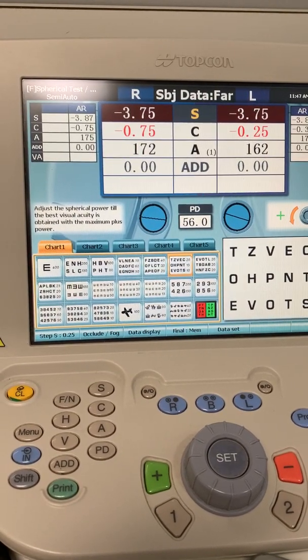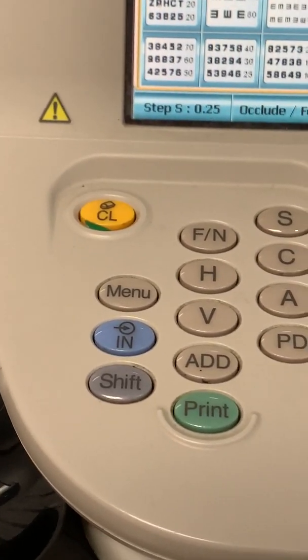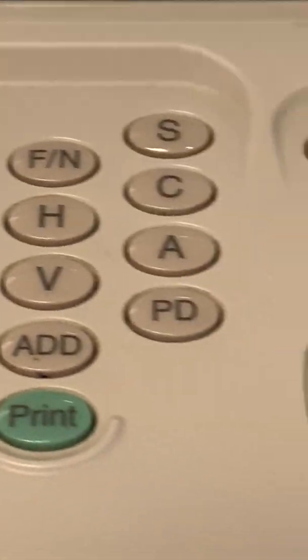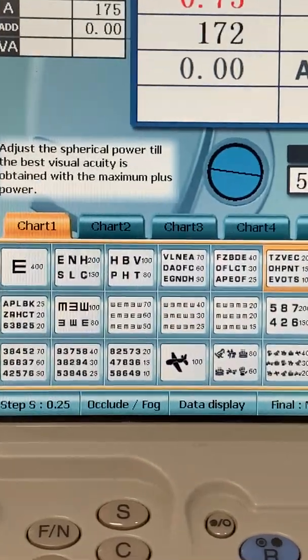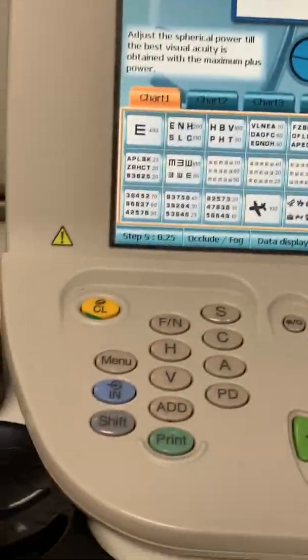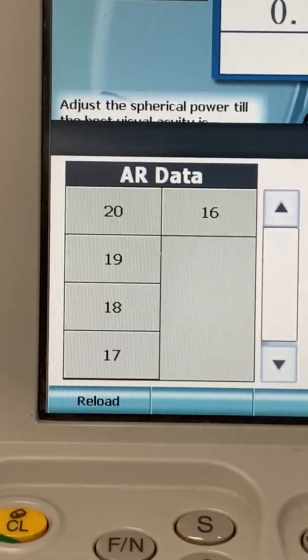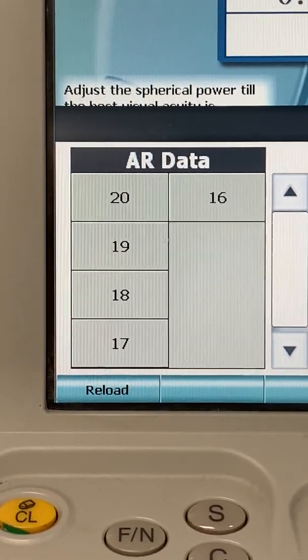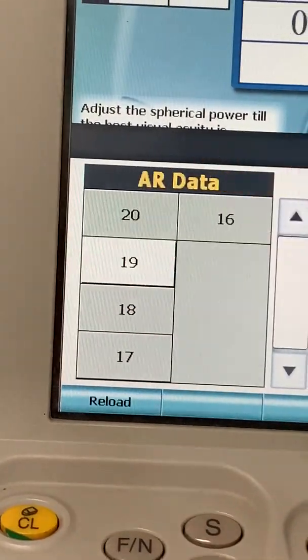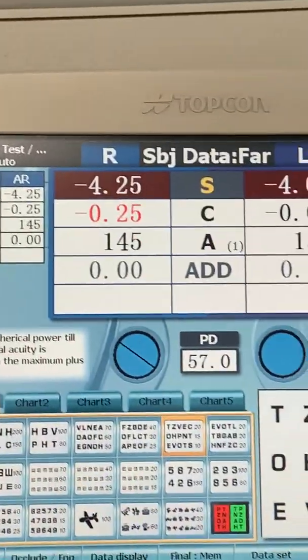To get the data from the autorefractor into the refracting unit in the exam room, we start off by hitting the IN button. We have buttons on the console unit, but there are also things we can touch on the touchscreen unit. The touchscreen is primarily to change the chart, and down here is to change the settings in the phoropter. We hit IN, then look at the screen and find the last two digits on the autorefractor readout — if it says 19 or 20, whatever it is, we touch that button. Then we hit the word OK, and it puts everything into the machine.